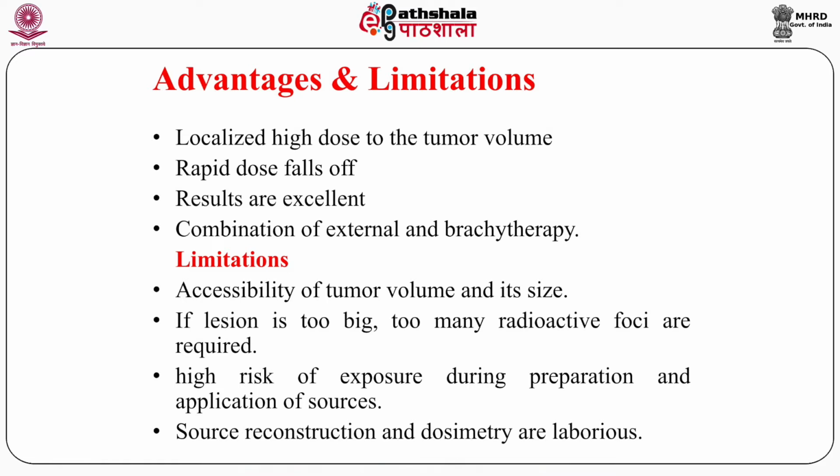So the advantage is that distant organs get very low doses. Since we can deliver very high doses to the tumor, the results are excellent. In most cases external beam therapy is also used, followed by brachytherapy.